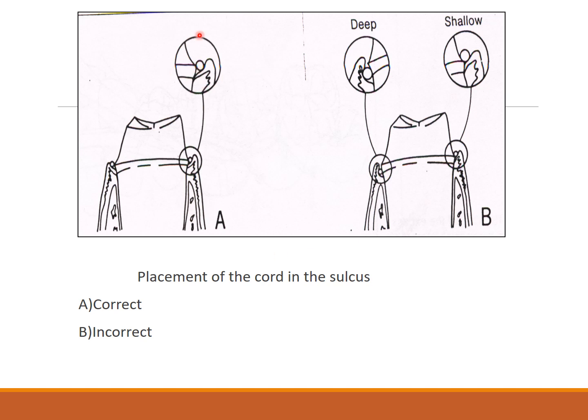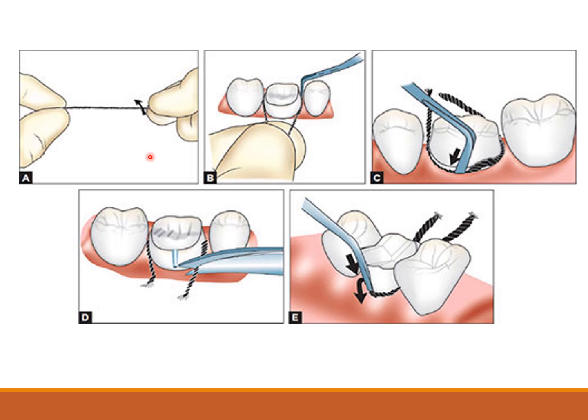You cannot place the cord so shallow, it has to be a little deep. So this is the correct placement, this is the incorrect placement, this is the incorrect placement. You can just compare. This is again just showing how you do it.